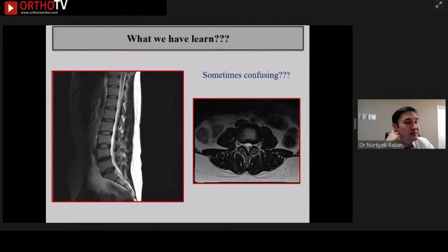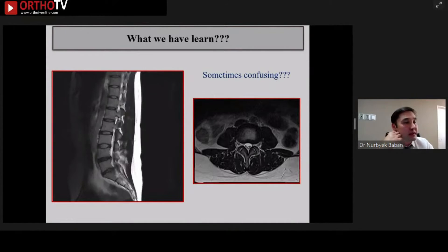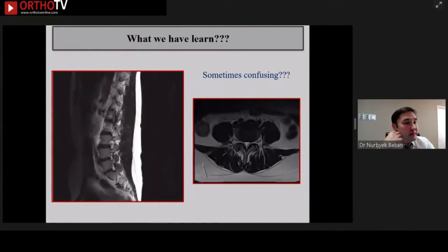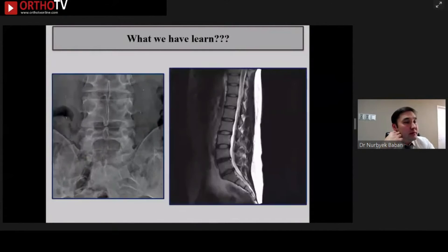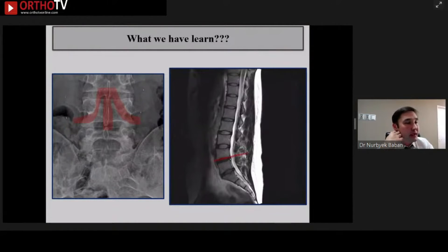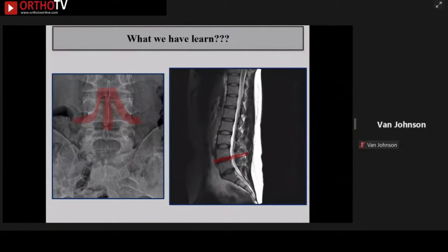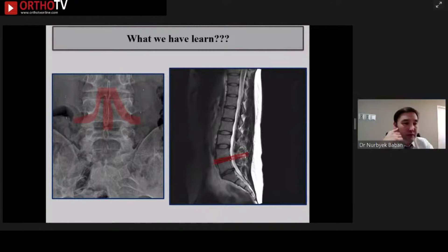In the sagittal view and axial view, it is difficult to identify lateral recess stenosis. In practice, in such cases, it is hard to make a decision to operate. We know that the nerve root is not located straight — the root is located diagonally. With the standard MRI axial view cut only at the disc level, we are only able to see a small part of the nerve root, so it is difficult to make a final decision.